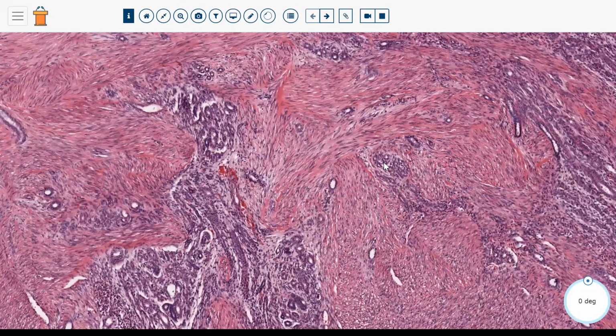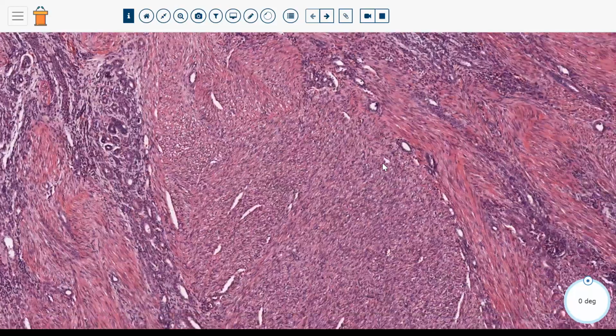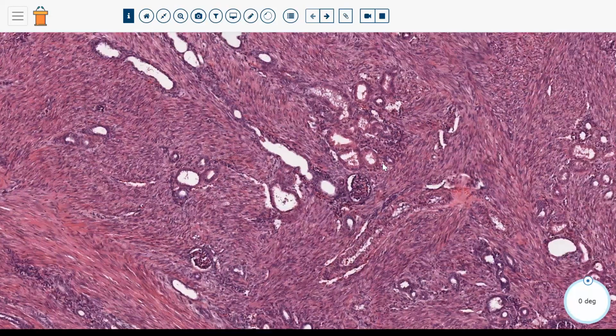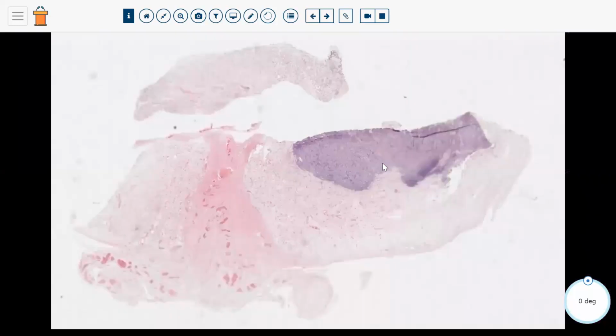Now, please forgive me, I am a renal tumor enthusiast, but I'm not a pediatric pathologist. So if any of you are pediatric specialists and there's something that I've screwed up about this particular case, feel free to reach out to me. My contact information should be on the conference website. But from the standpoint of a GU pathologist and a renal tumor nerd, I think this is a pretty good example of a congenital mesoblastic nephroma. But again, please feel free to reach out to me if I've made some horrible mistake here.